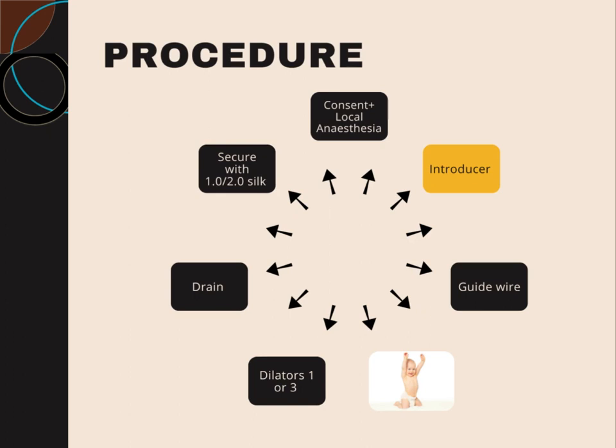When you're inserting lignocaine, you need to insert and then withdraw 1 centimeter back and then infiltrate, like in a dental block. That's a technique you need to be aware of before giving local anesthesia. And then the next thing would be the introducer.